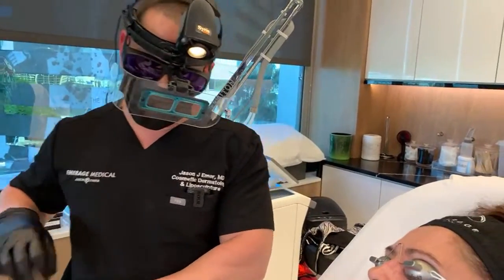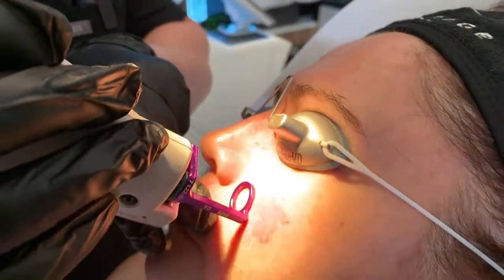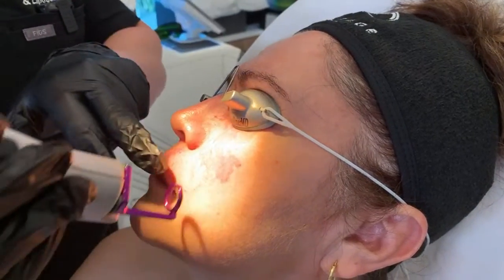If you go too fast it causes white patches and holes in the skin — you don't want that. You want the skin to heal naturally. So let's do a pulse and see. Look at that — you see that purple-blue? This is literally destroying the blood vessels that are causing this clump here.